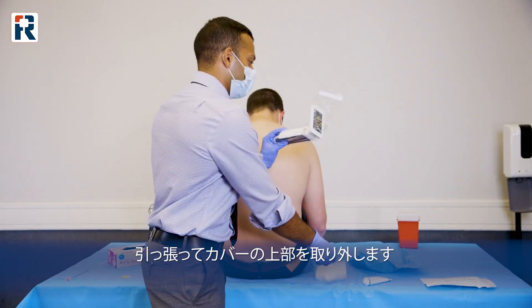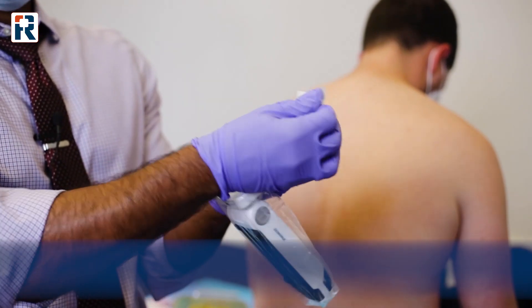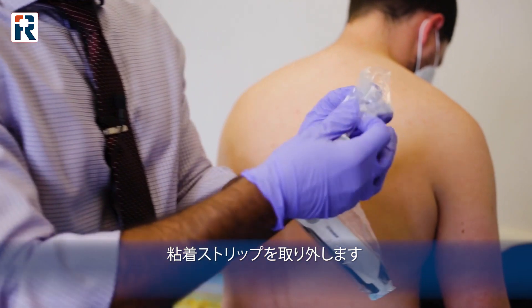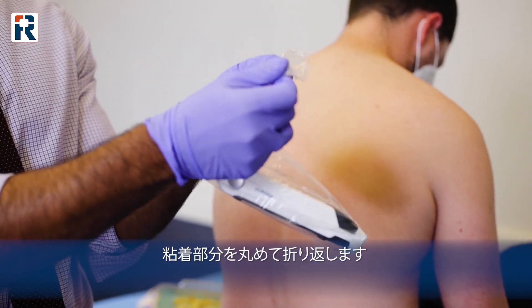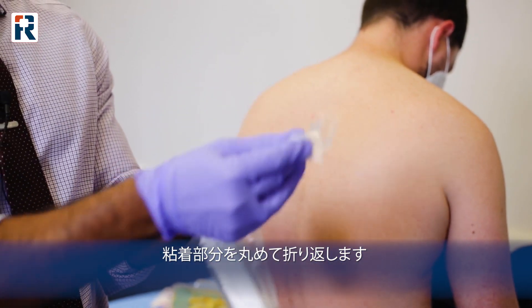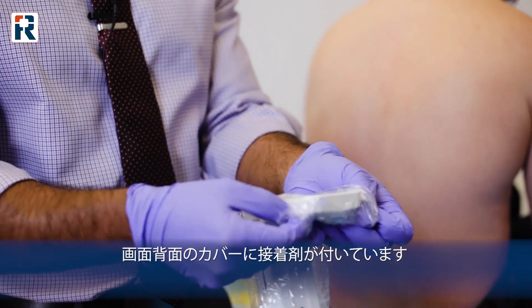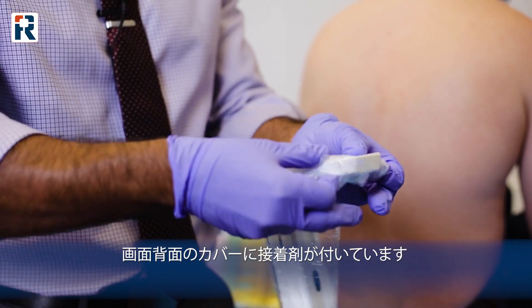You don't need this anymore. You're going to see this white portion right here — this is our sticker. We're going to take this off, and then you're going to take this portion and fold it back over itself, and this will allow it to stick onto the back.